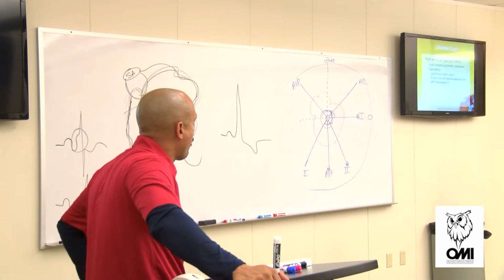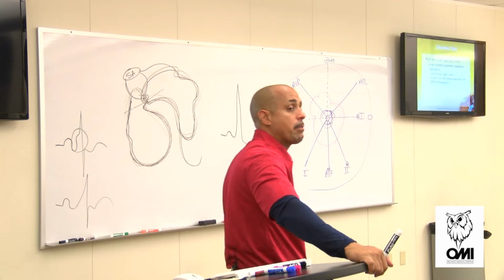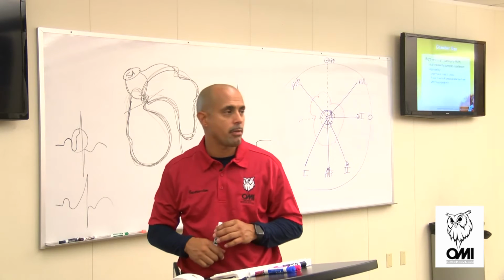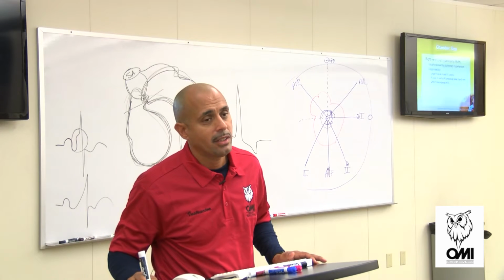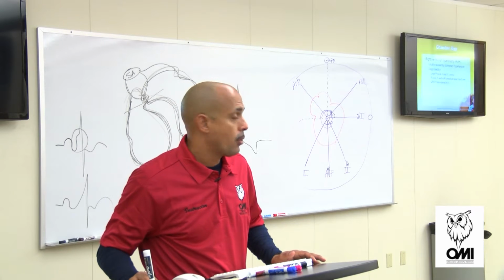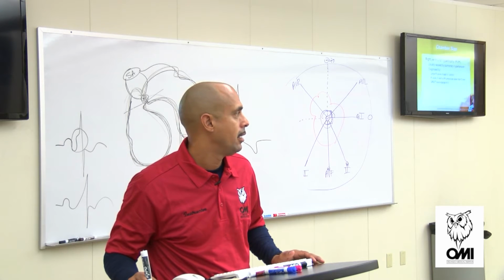All right, so let's talk about right ventricular hypertrophy, RVH. It's usually caused by pulmonary hypertension. Can you stick a cuff around a pulmonary artery and measure the pressure? No. But you know how you could? If I have right axis deviation, that could be a sign of pulmonary hypertension. So what will cause pulmonary pressure to be so high? Take a guess.